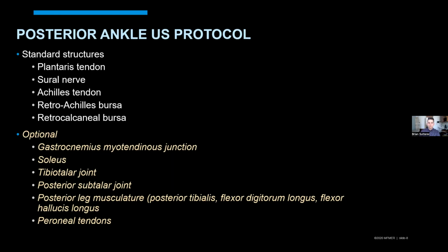And then I get a short axis of the medial tarsal tunnel. I do this for two reasons. One is the protocol should be designed not only to be a thorough evaluation of the area, but also include a differential diagnosis of pain in that area. Problems in the medial tarsal tunnel can give heel pain.